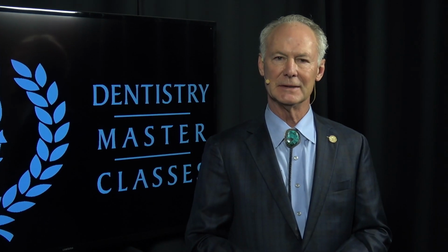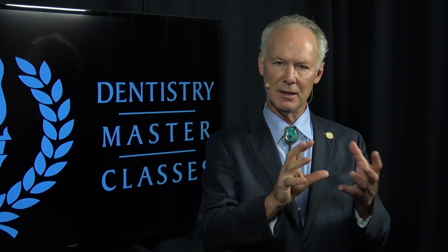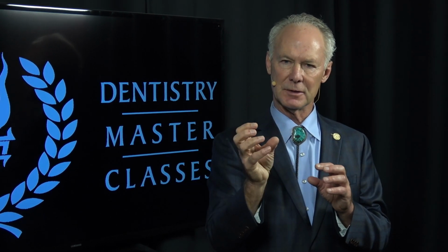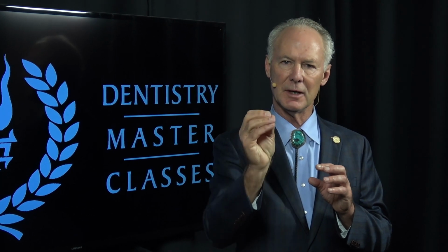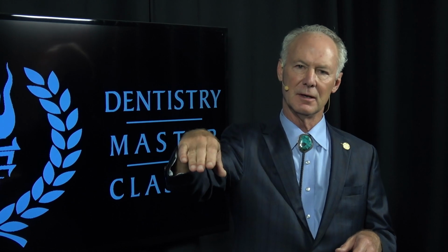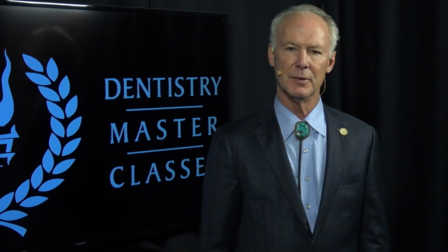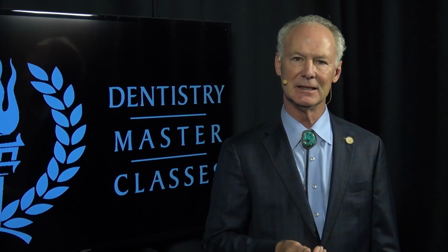If you had a patient that was a big time clincher, there might be a bit of an issue because the implant doesn't give. The tooth has got a periodontal ligament around the tooth, which is like a shock absorber, and it will give just a little bit. So you might have an issue with the bridge disconnecting to one of the abutment teeth or the other if they were a big clincher. Be sure to put the patient in a night guard, though, to prevent them from clenching on that bridge at night when they're sleeping.